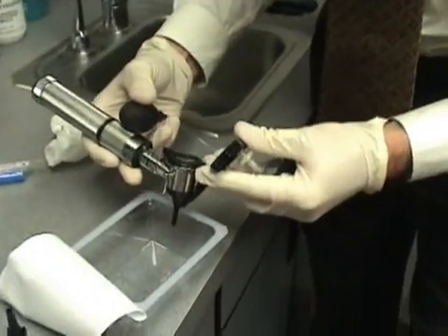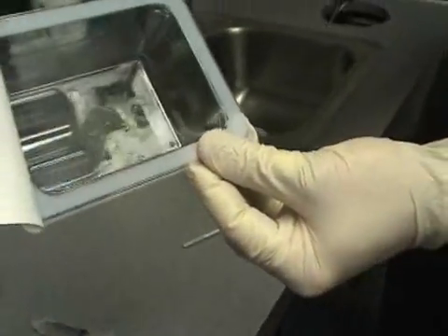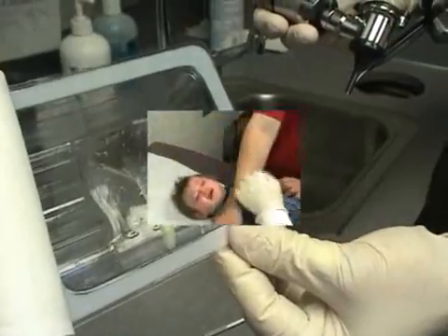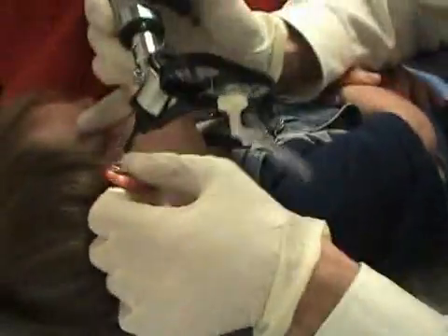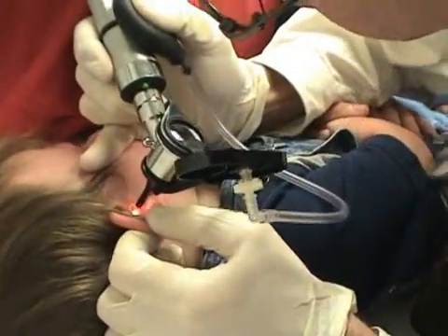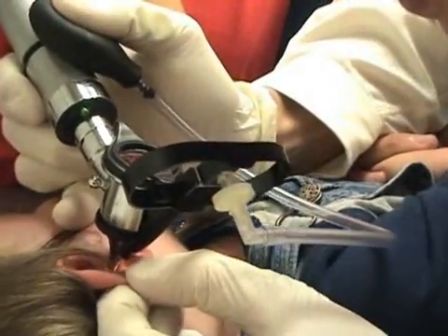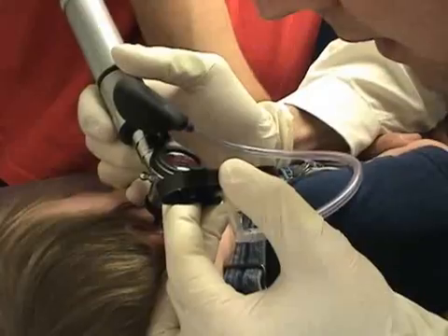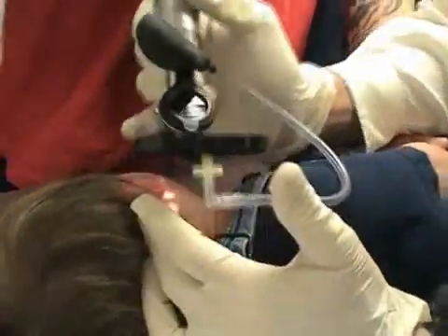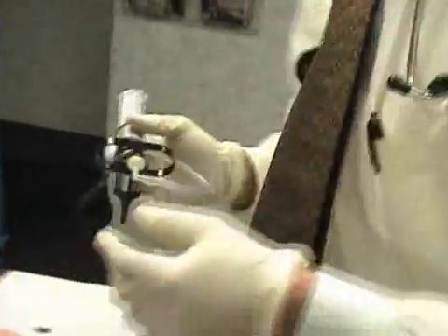Squeeze this out here. That's a lot. Okay, here we go. I just kind of locked up the bulb there too. Go ahead and pick him up. There we go.